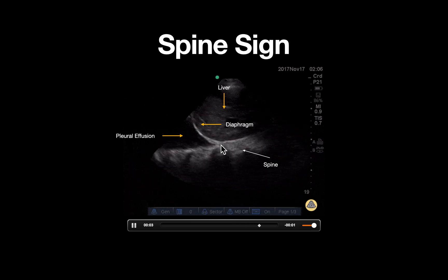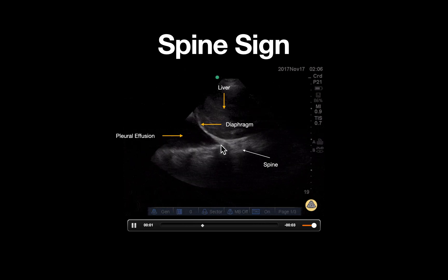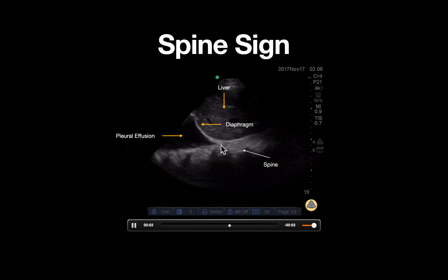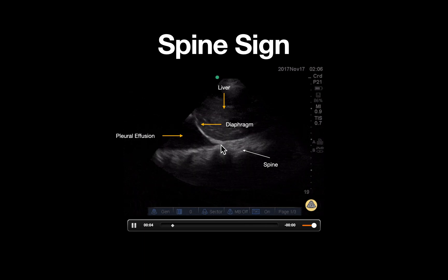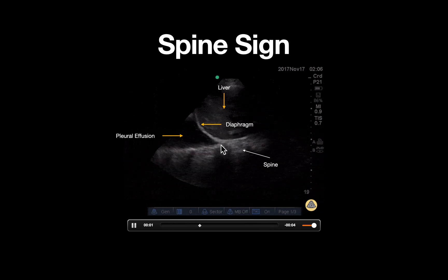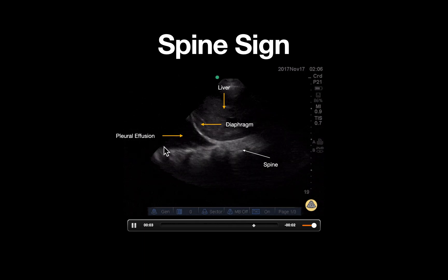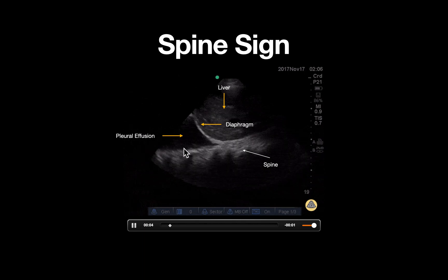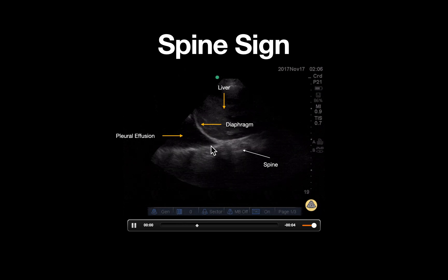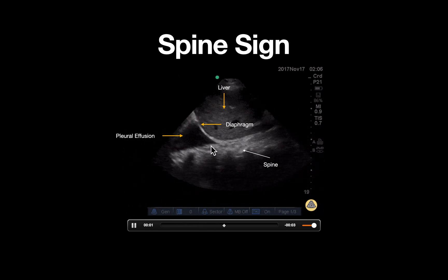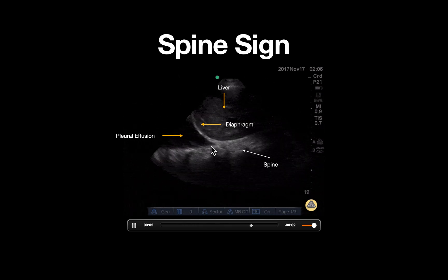However, in the case of a pleural effusion, a medium has now been created for ultrasound to travel through, allowing visualization of the spine deep to the thoracic cavity. This is known as a spine sign and is diagnostic of a pleural effusion.